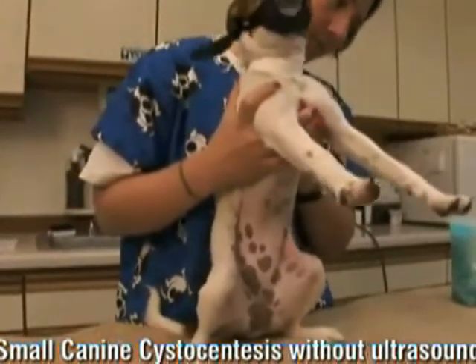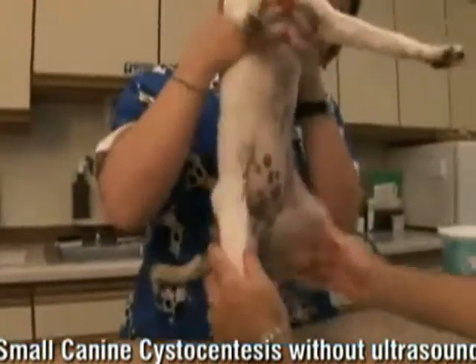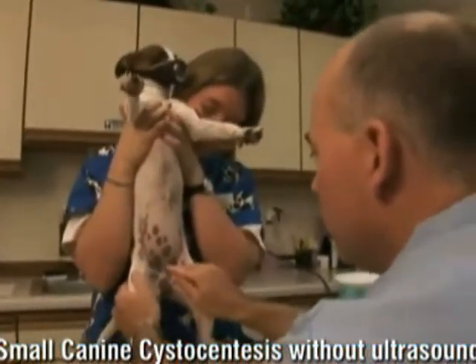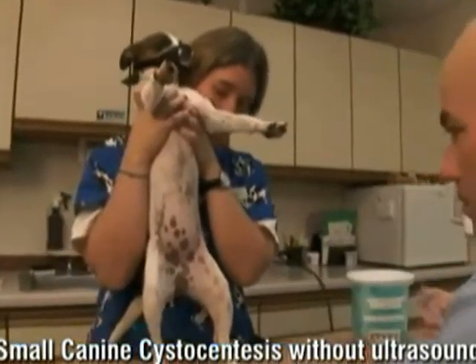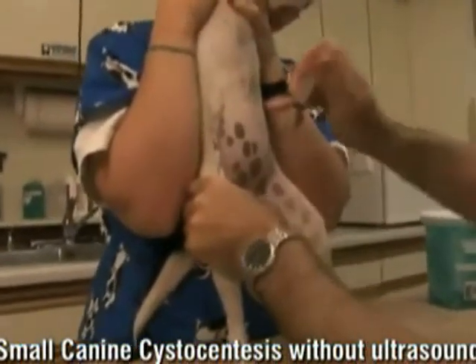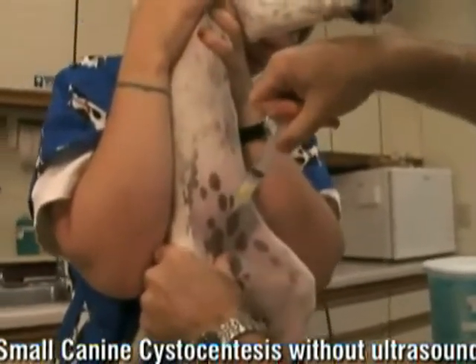Alright, so now we're going to do urine collection on a small dog without ultrasound. To be honest, I would rarely — pretty much never — scrub, but we will for camera purposes. It wouldn't hurt to do a quick little scrub; usually we just wipe with alcohol. What we like to do on the small dogs — you can certainly lay them on their back, but what we like to do is have Honey hold her up by her front legs, and that lets gravity help us.